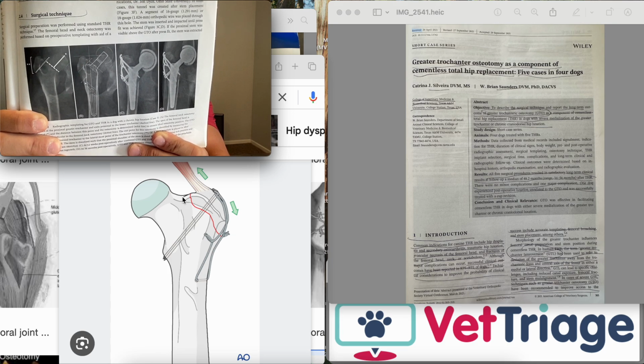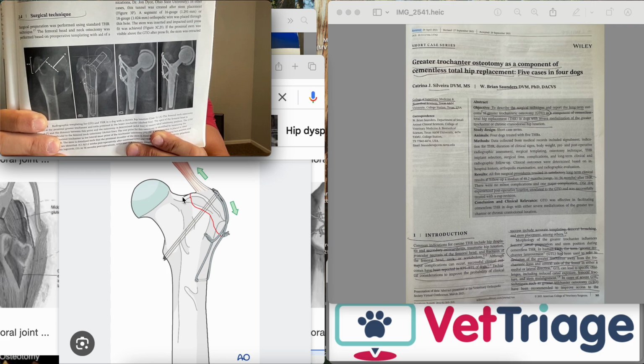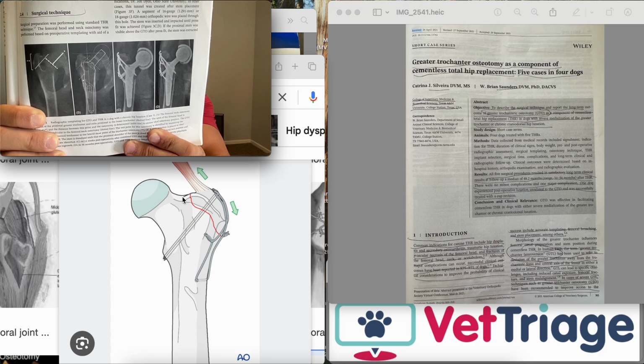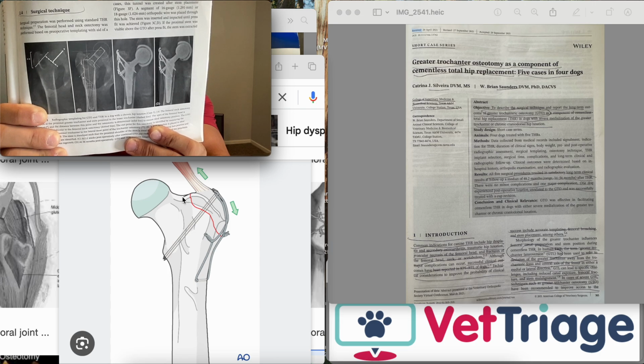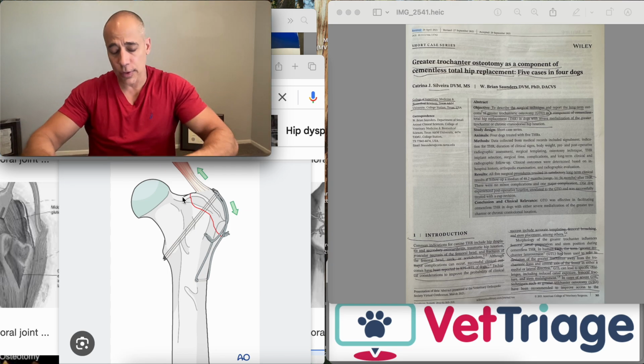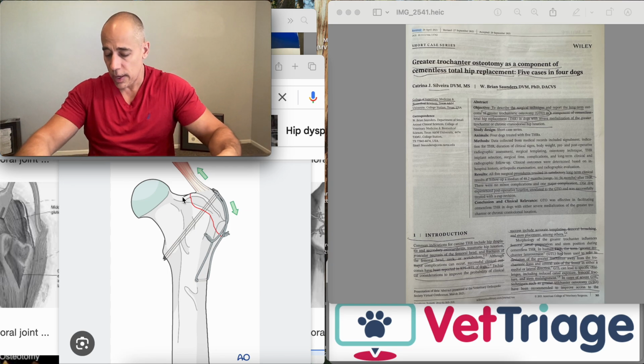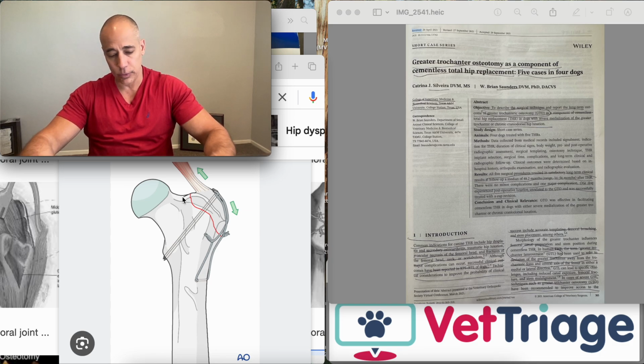Then B is the placement of the femoral stem, neck, and acetabulum. And then C and D show the post-op and then long-term healing. You can see the pins they placed there as well as the wire. So they were actually able to place the pins in the greater trochanter and avoid the implant. Very cool.